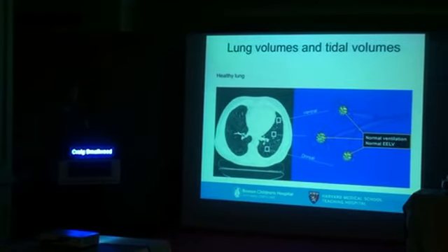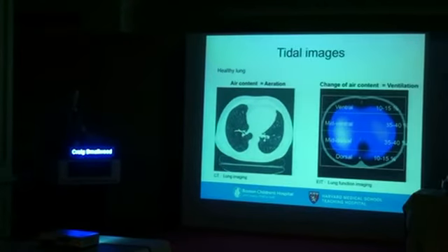So every single piece of that lung, from the most ventral to the most dorsal, is mostly homogeneous. And if we have a really sick subject, that image would not look like that at all.